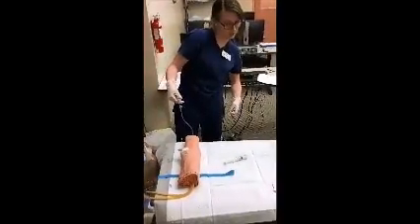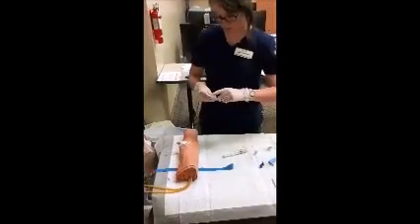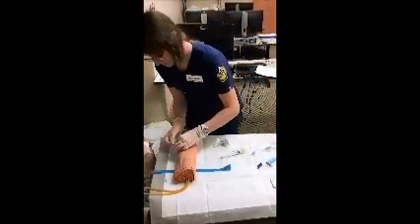So now we're going to go ahead, you can set this here. And I would alcohol our site right here.